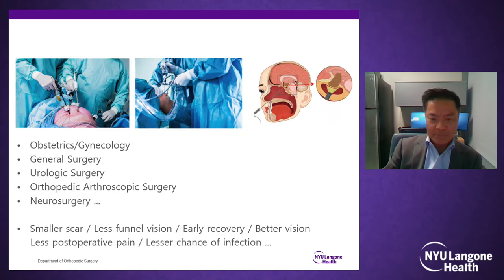And why is that? Well, as you know, endoscopic or arthroscopic surgery has been around for a long time. Those of you who are orthopedic trained know a significant component of our training years are spent on doing arthroscopy of the knee, elbow, shoulders, whatnot. If you have a joint, we'll scope. Same thing with neurosurgery. I'm sure you guys have done your share of scopes.